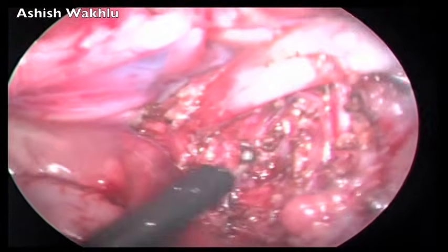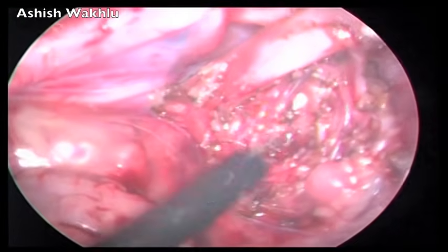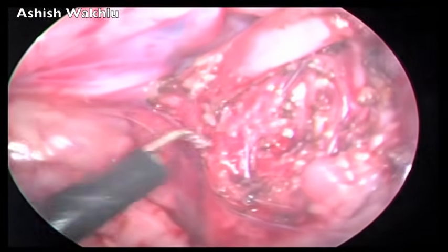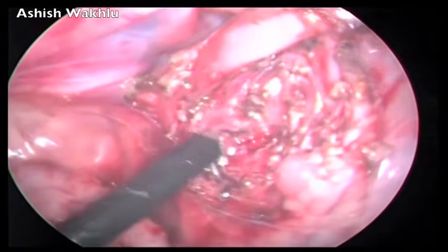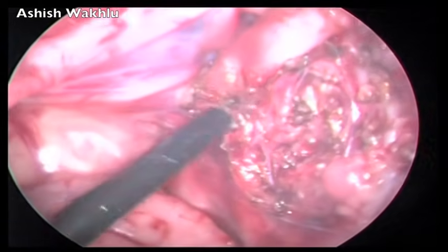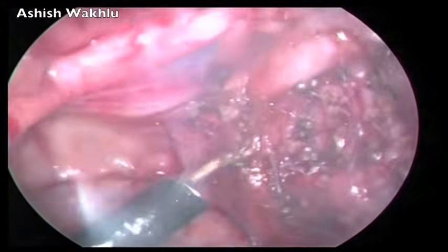So just checking to see that it's safe and that the hook is traversing the mesentery. We continue with the dissection of the mesentery to narrow down the fistula, moving both upwards towards the sigmoid colon and downwards towards the pelvis to achieve adequate mobilization.